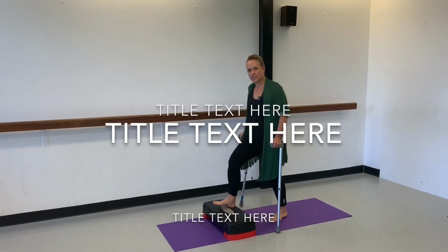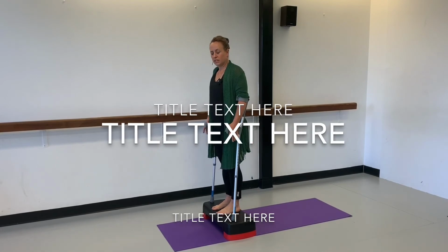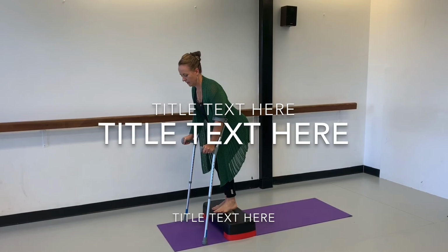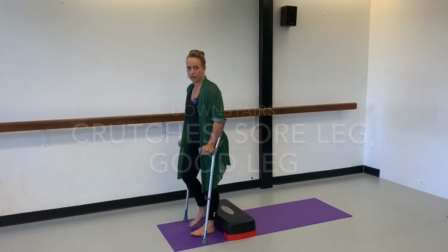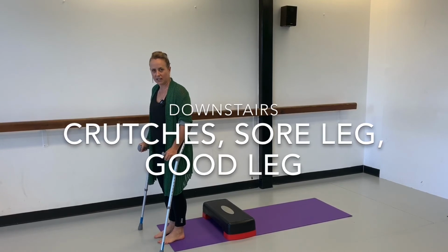To get down the stairs is sometimes a little bit more daunting, but from the top of the step, we say sore leg goes down first. So you'll take your crutches, then your sore leg, and then your good leg. Crutches, sore leg, good leg. So that's how you get downstairs.